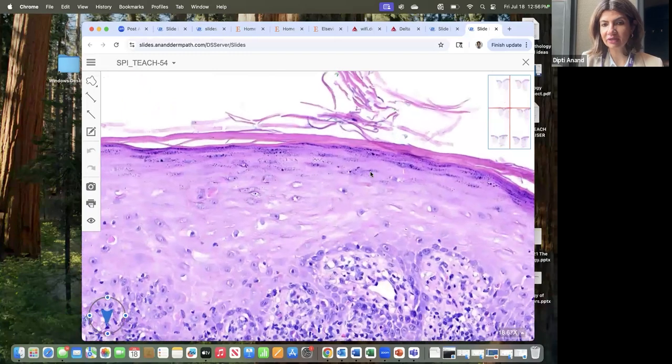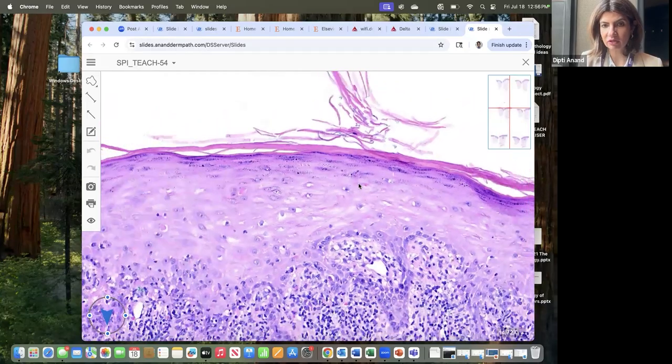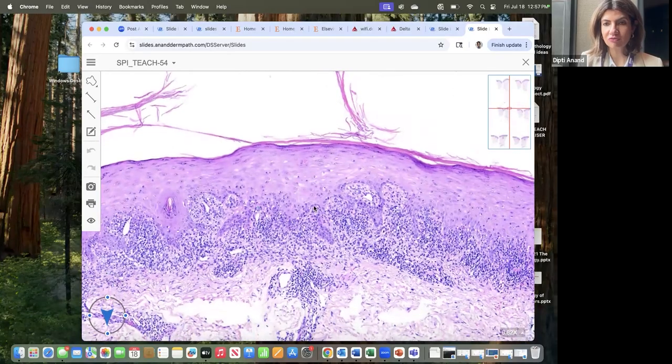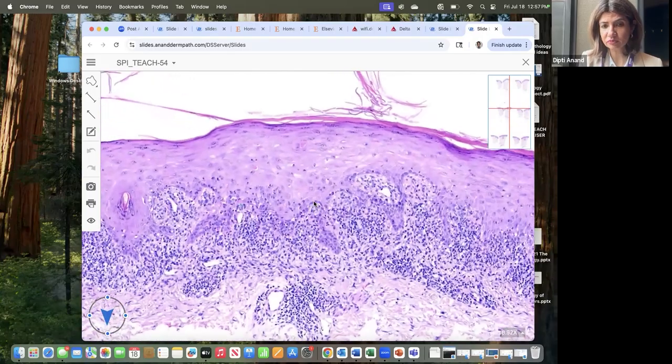So there is a thick granular cell layer and it is in an inverted triangular form because the apex is here. So wedge-shaped hypergranulosis. Besides this, you see the hyperkeratosis, and the classic lesions of LP should not have parakeratosis. Okay, so you have lichenoid inflammation. You have the irregular, jaggedy, sawtooth acanthosis. You have the wedge-shaped hypergranulosis, the hyperkeratosis, and no parakeratosis.